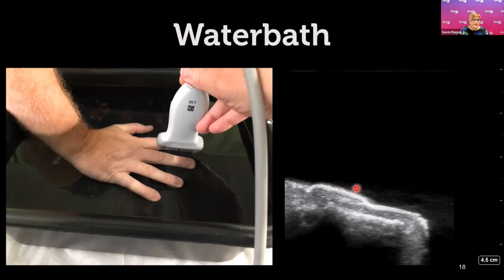The advantage of this technique here, as you can see, we're looking at a nail bed, and you can actually see the fingernail here and where it kind of hangs over a little bit. Maybe need to cut their nails. You can also see really good detail of the skin, and because we're not squashing the tissue, we see the superficial tissue really nicely.